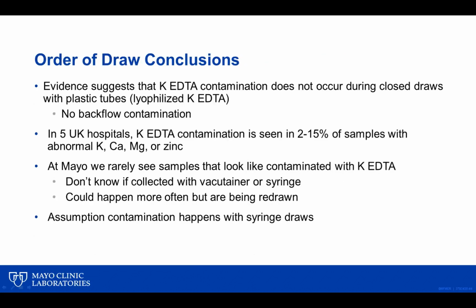So there's really no evidence of backflow contamination where potassium EDTA sticks to the Vacutainer adapter and then contaminates a serum or plasma specimen collected next. So then you may conclude that, for routine Vacutainer collection, that order of draw really makes no difference.